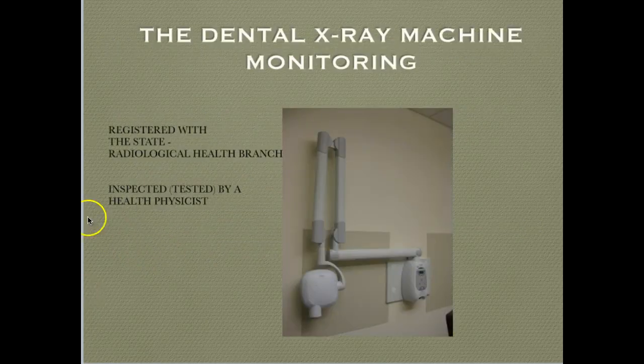Let's look at the dental x-ray machine. So monitoring here would be, is it registered with your state if that's required, or your county, and has it been inspected by a health physicist? So they come with little machines to make sure that your x-ray units have the proper output of radiation, and also you can, we'll look at it in a moment, make sure that there's no PID drifting.